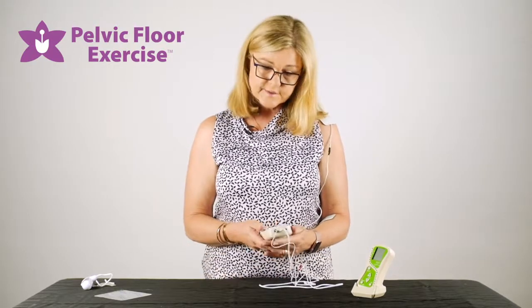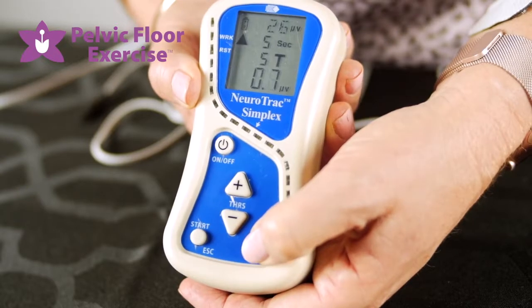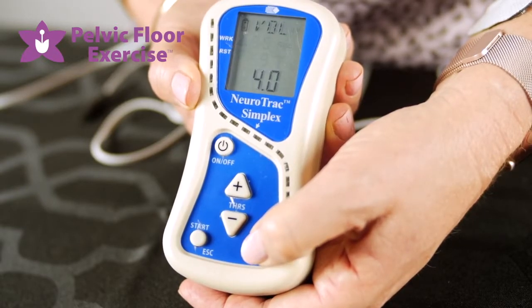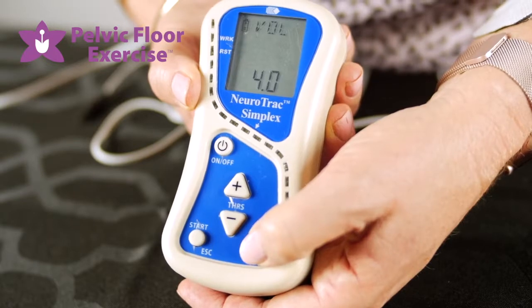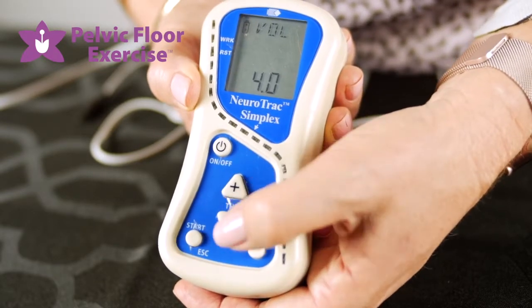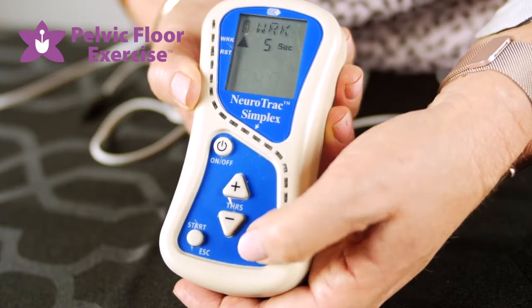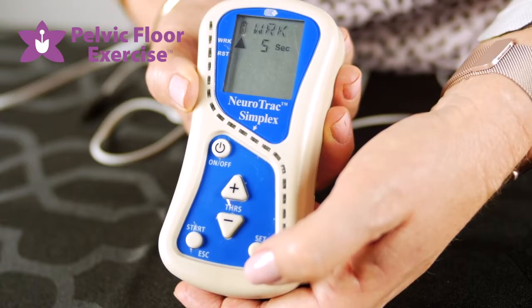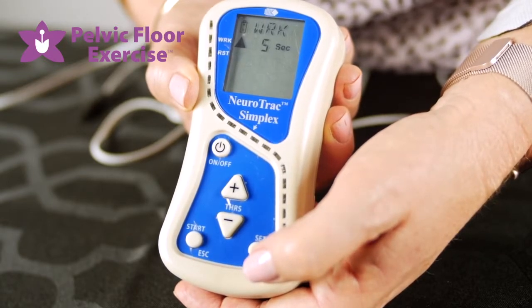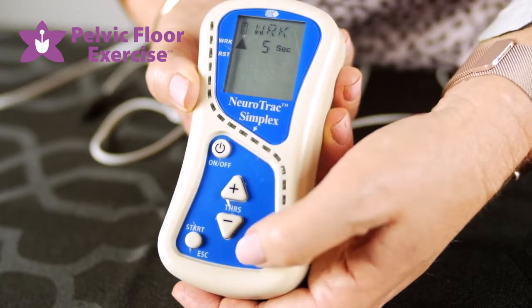To change these parameters, hold the SET button down for three seconds and you'll see on the screen we now have volume, so I can increase the volume of the beeping that gives us the biofeedback. If I scroll again, work comes up on the screen — that's how long you want the contraction to be held for — and using the plus and minus buttons we can change that.